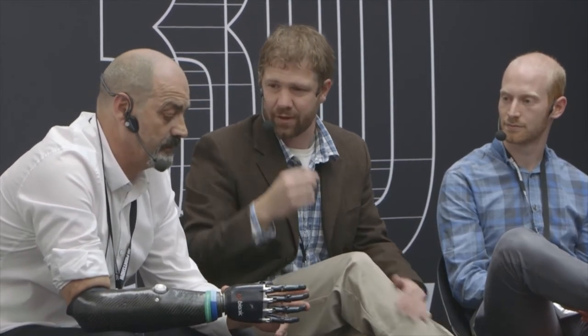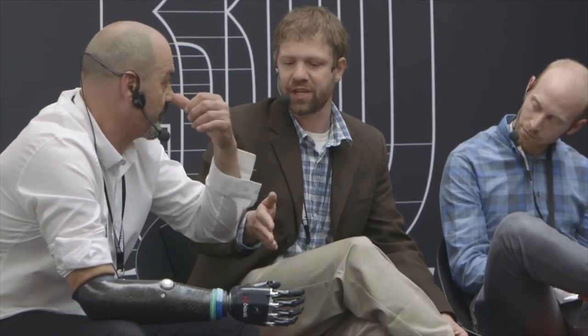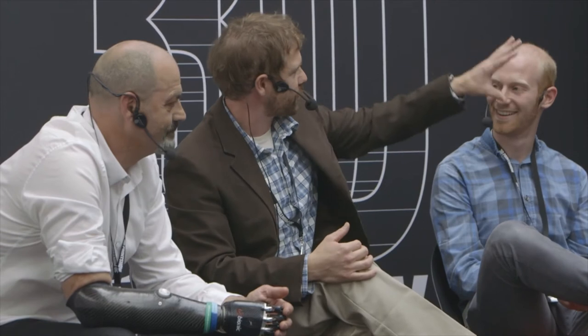If you wanted to buy the hand now, I think you have to go through distributors. Well, you were saying earlier, cost price is about 11 or 12, but to buy it, it's about 15 grand. So you got to realize that what you've developed is actually a new terminal device to replace the $15,000 thing, not the $100,000. No, because our $1,000 included fitting and a socket. Right. But what you were showing on the slides was just the terminal device.